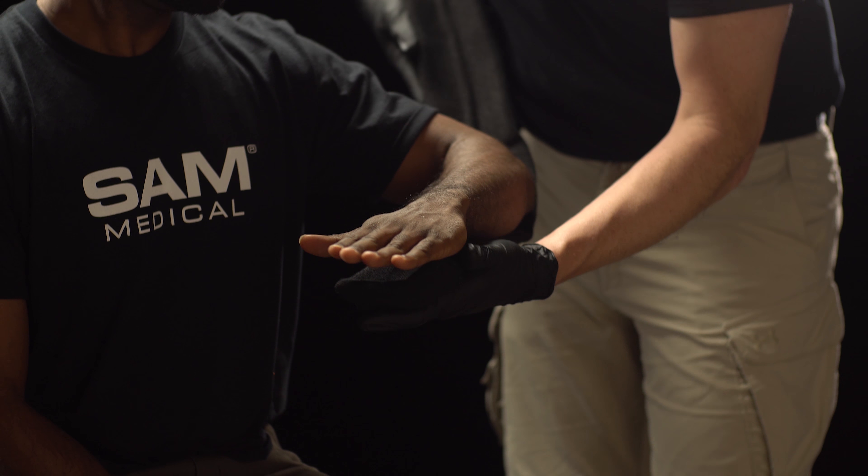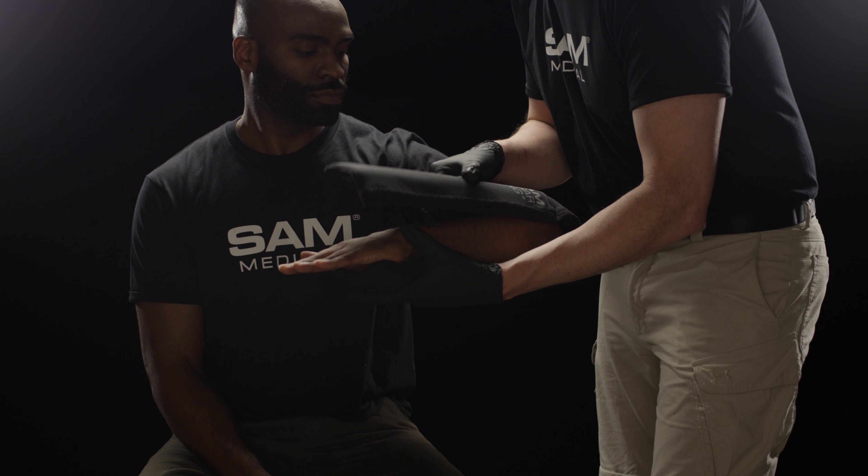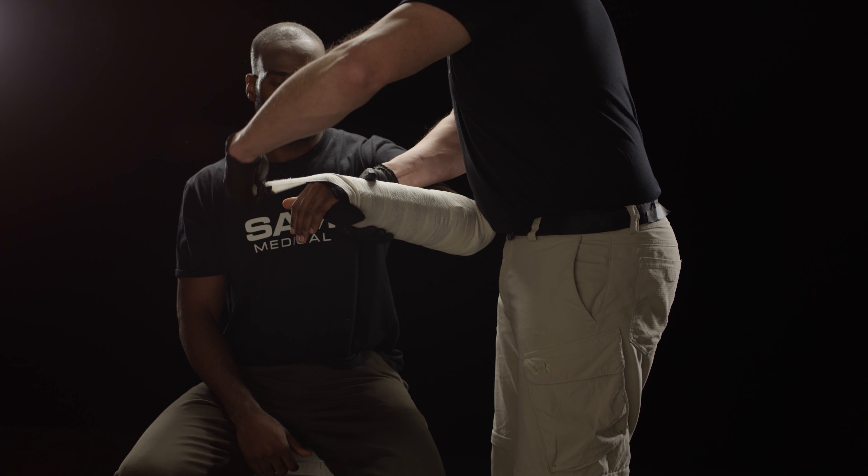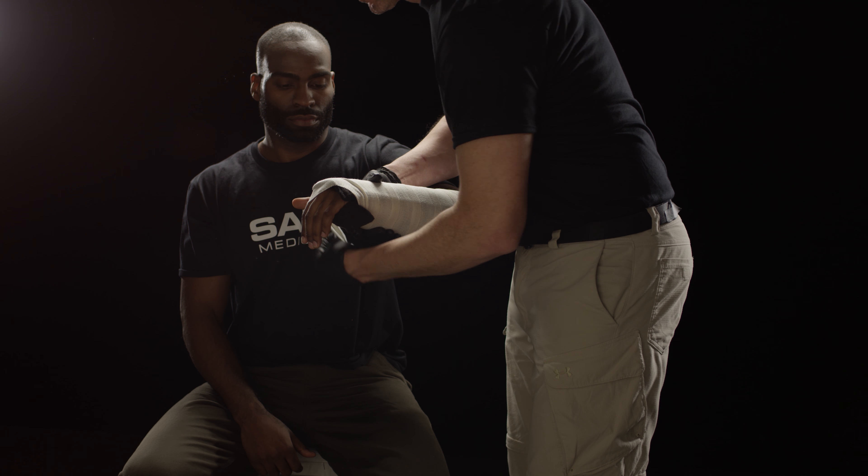Apply the Sam Sugar Tong Splint to the patient's arm. Make fine adjustments and secure with wrap of choice, ensuring the thumb and elbow areas are snug.